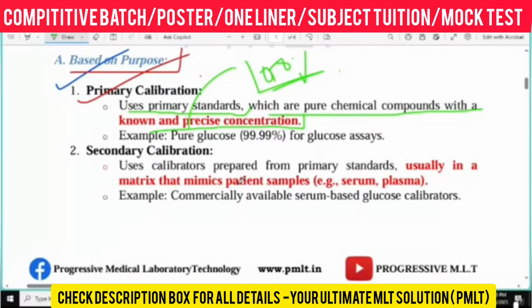Now I am coming to the secondary calibration. How does it look? See, use a calibrator prepared from the primary standard, usually in a matrix that mimics the patient sample or serum. Primary calibration is only the standard, but secondary calibration requires small amounts of patient serum or plasma in the surroundings. That is called secondary calibration. You can easily purchase it because it is commercially available.